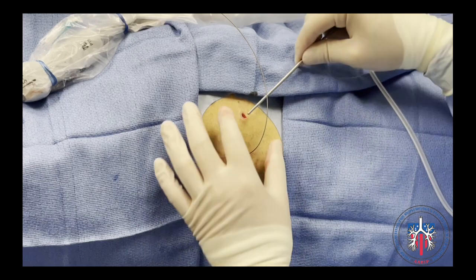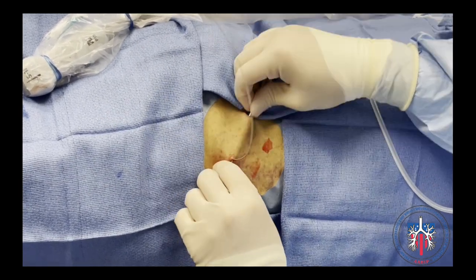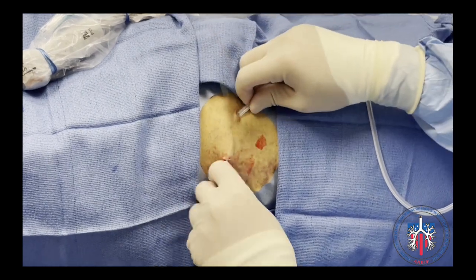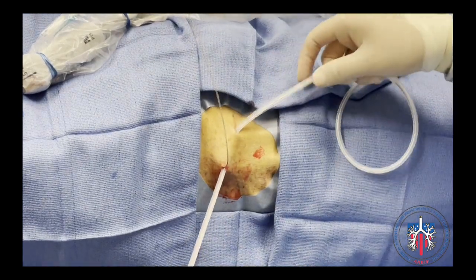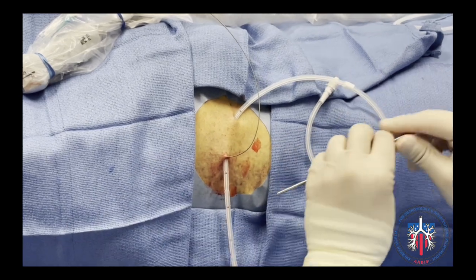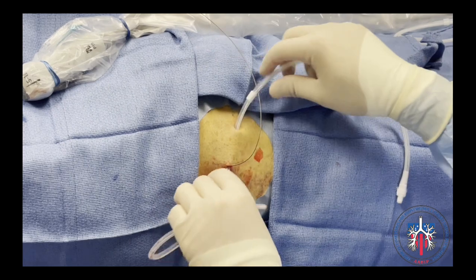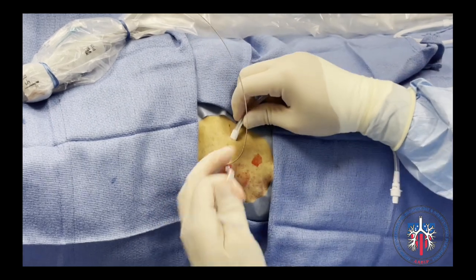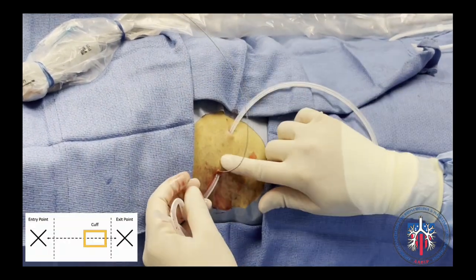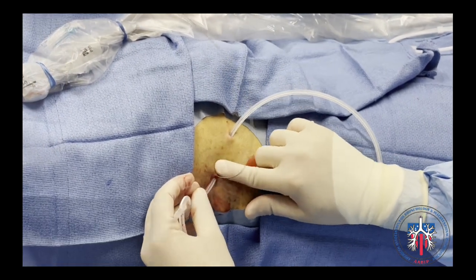The tunneller with the indwelling pleural catheter attached on the other end is inserted through the exit point towards the entry point via the subcutaneous tract. Once the fenestrated end of the pleural catheter is pulled through the entry point, the tunneller can be removed. The pleural catheter is pulled further to position the cuff inside the subcutaneous tract, slightly towards the exit point. With the cuff closer towards the exit point, this will allow for easier removal.